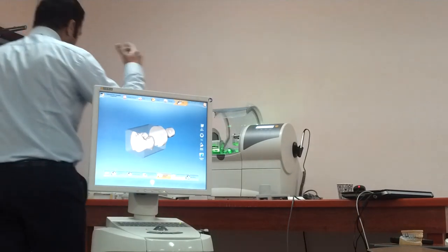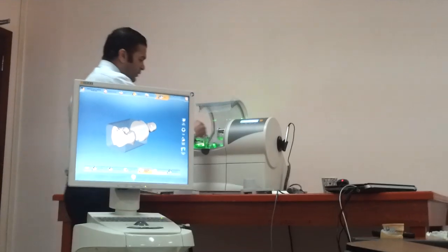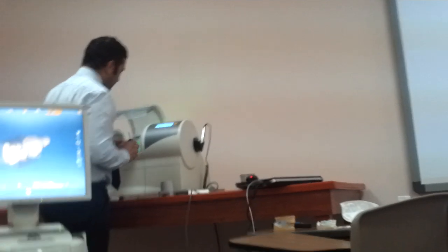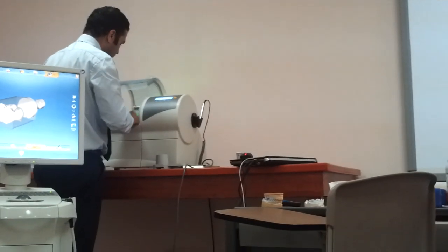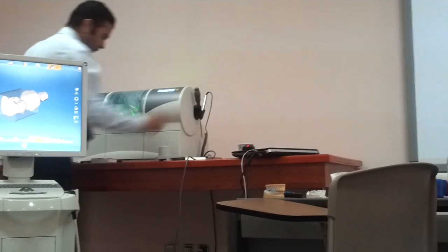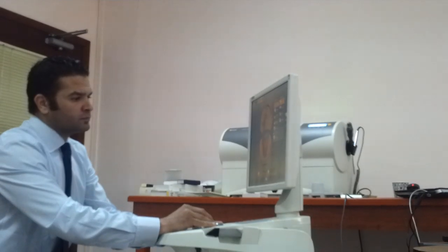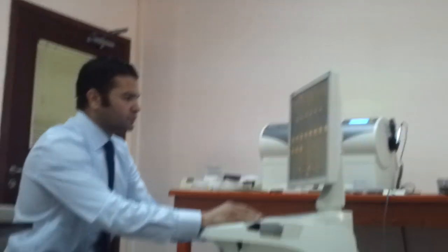Now for the second part: the CAM part — computer-aided manufacturing. I'll insert my block into the milling machine and give an order to mill it. The unit will tell you which block size to use, and you select your material. We have different materials depending on the site of restoration: for the anterior, polychromatic blocks for aesthetics; for the posterior, stronger materials such as zirconium.